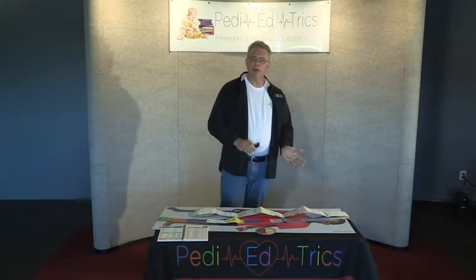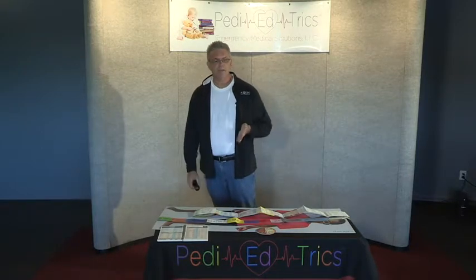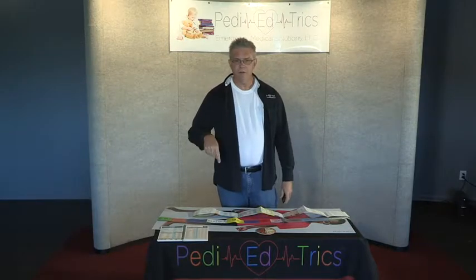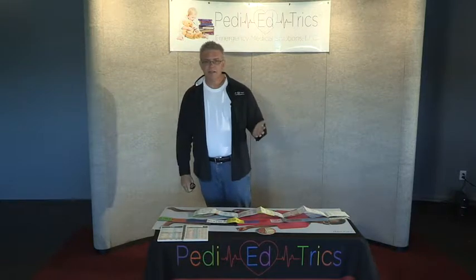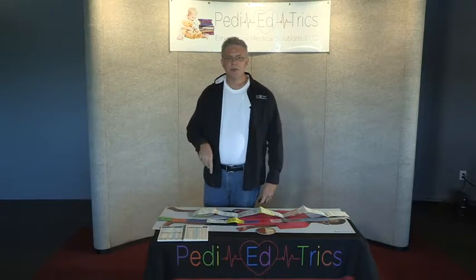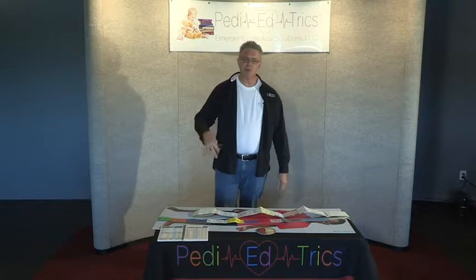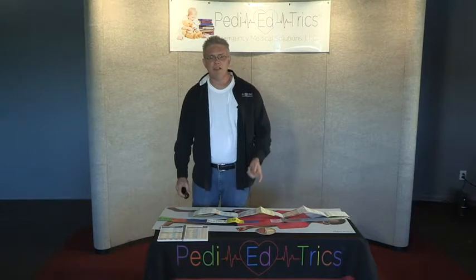Now, whether it's in the book or, as you're noticing hopefully a trend, you get the same information on your app as well. Now, IV is going to be anywhere, any size. Otherwise known as this child is IO. Because when it comes to children, just like adults in full arrest, more and more places continue to teach that unless you have an IV in already, don't bother. Just grab their bone, drill them, and be done. Because once you've got your IO in place, you can push your fluids, push your epi, and when they're a little bit more stable, then you can take your time and try to find something else.